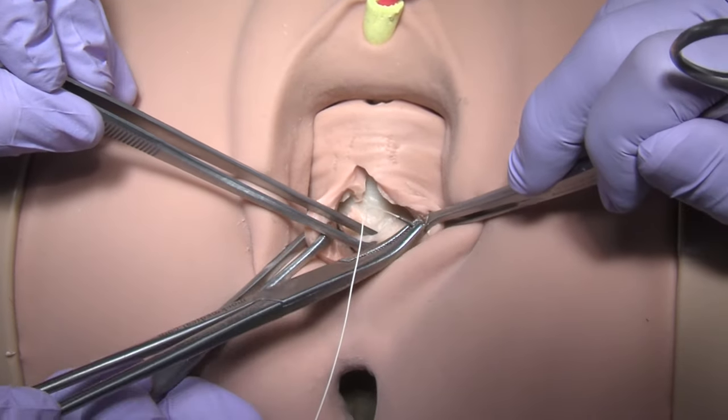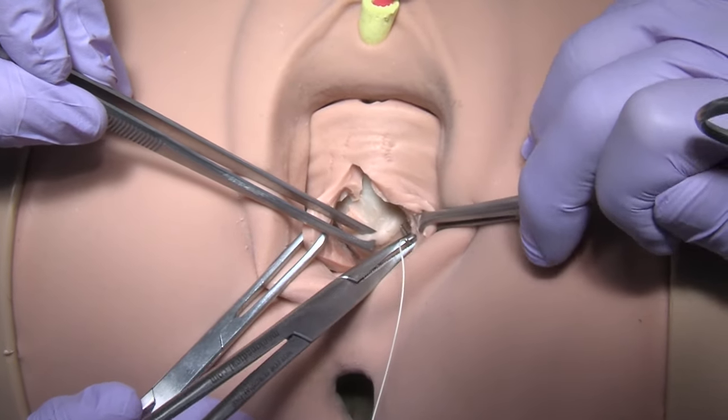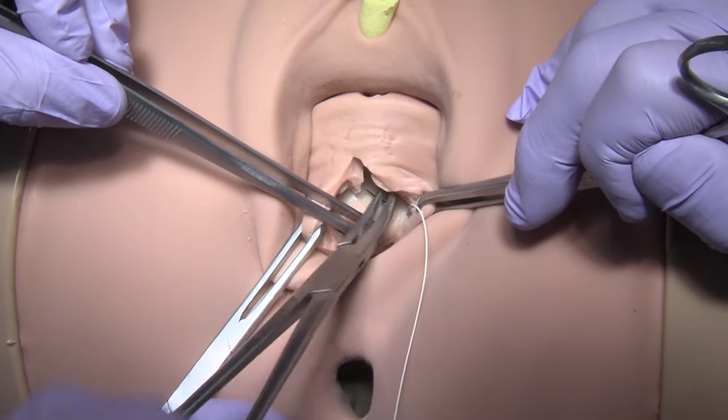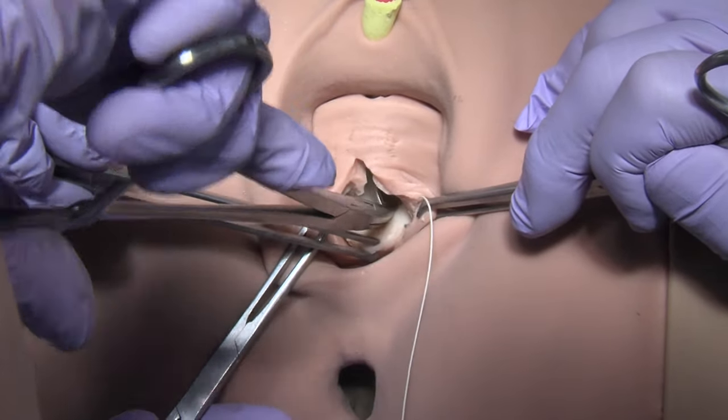With 2-0 delayed absorbable suture, plicate the prolapsed fibromuscular layer in one or two mattress layers.